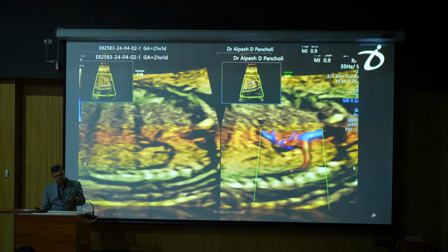Now coming to the venous system abnormalities. So what can be the different systemic venous anomalies? In the abdominal venous system, we have persistent right umbilical vein, varix, DV agenesis or abnormal connections of the DV, and portosystemic shunts. We can have persistent left SVC and interrupted IVC with azygous continuation. So we will discuss one by one.